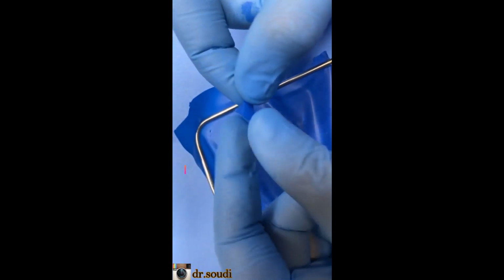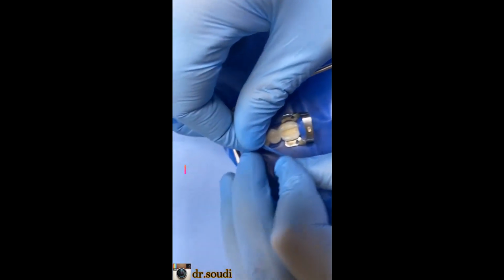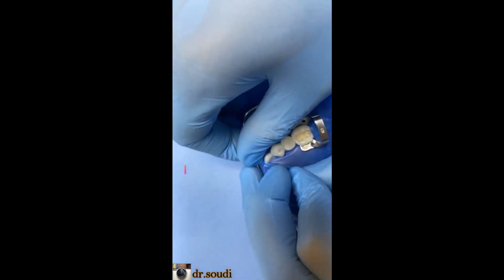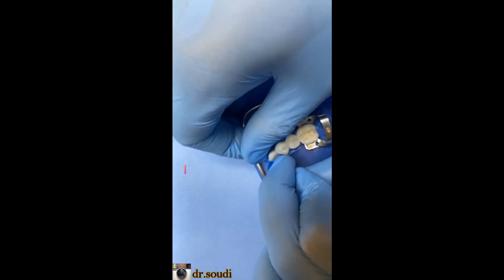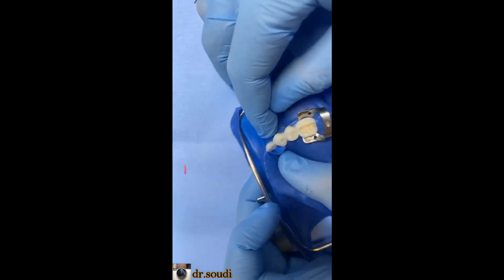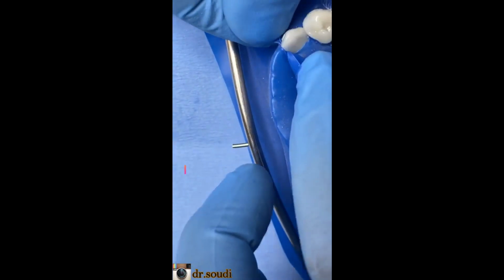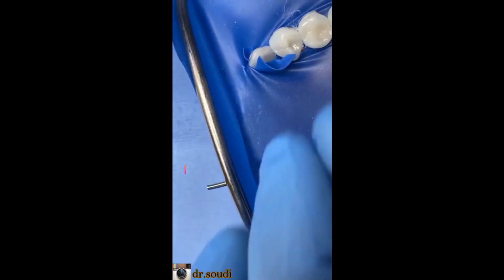Cut a small rubber from the sheet and stretch it like this and place it anteriorly in the contact like this. If you have a tight contact, it will be stable like this. You can see it now, right? Like this. Your anterior part will be secured.